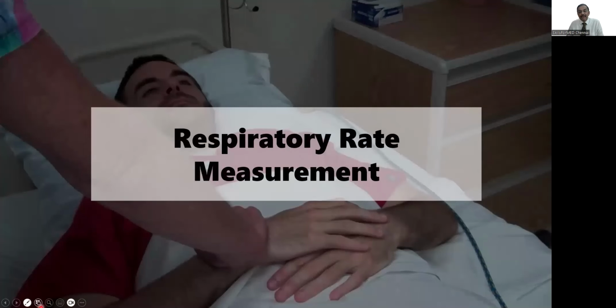So that's about temperature, not much. Basically, it is you choosing the right method and also being aware of the activities and the drinks which the patient can take, hot drinks especially or cold drinks, which can affect the accuracy of the reading, and also noting the circadian rhythm of the patient. Let's go to respiratory rate next.